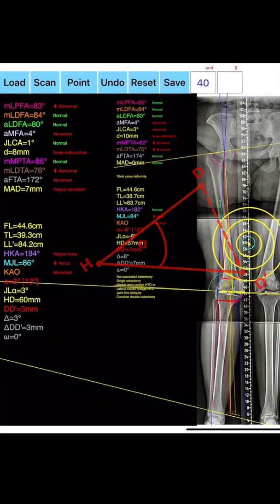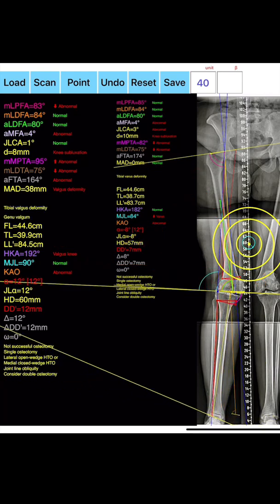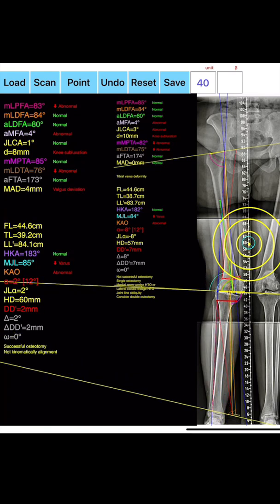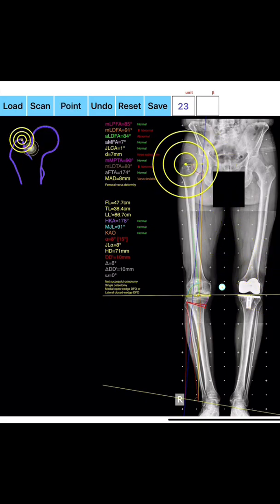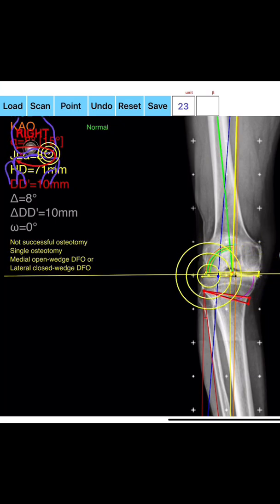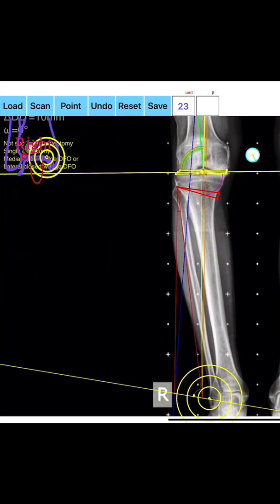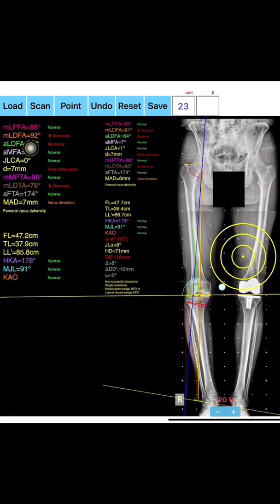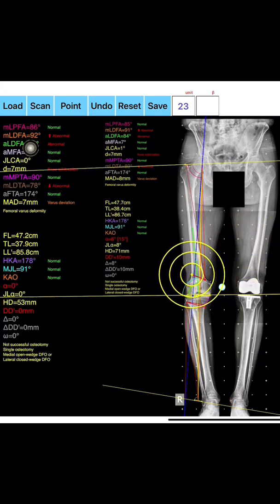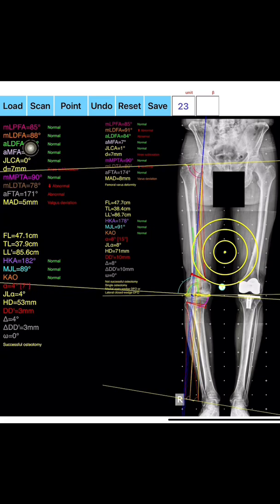Both proximal tibial osteotomies — HTO (high tibial osteotomy) — and supracondylar femoral osteotomies — DFO (distal femoral osteotomy) — can be performed in additive technique (open wedge) or subtractive technique (closed wedge) and can be planned. This powerful feature allows the surgeon in real time to simultaneously obtain all relevant parameters by changing the correction angle, helping to differentiate between femoral and tibial causes of deformity and avoiding osteotomies that could worsen joint obliquity. By pressing the undo button, the user can easily return to a previous stage and modify the selection of points or change the above-mentioned parameters.